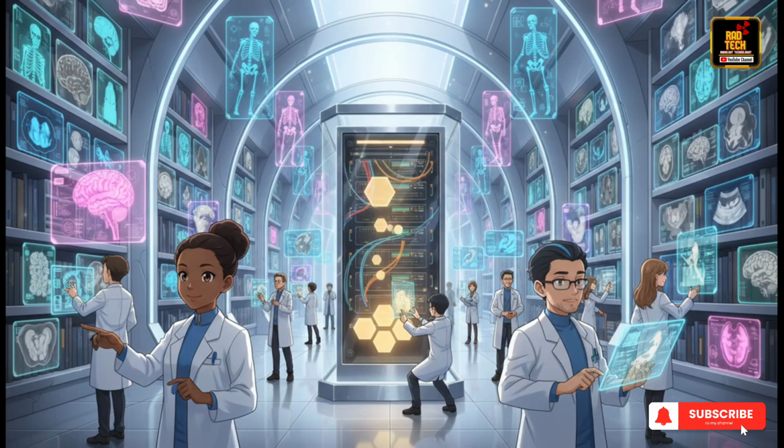We're talking no more running around with those big film jackets down hallways. Probably the best way to wrap your head around it is like this. PACS is a giant, super secure digital library. Every single scan a hospital takes, every X-ray, MRI, ultrasound, you name it, is like a book that gets instantly cataloged and put on the shelf, ready for any authorized doctor to check it out, anywhere, anytime.